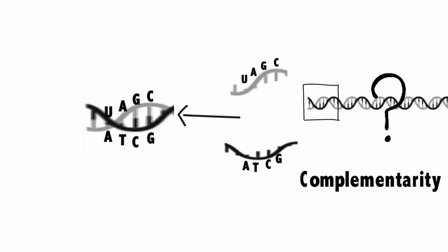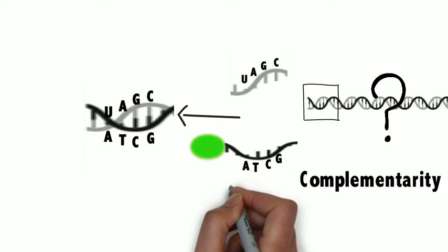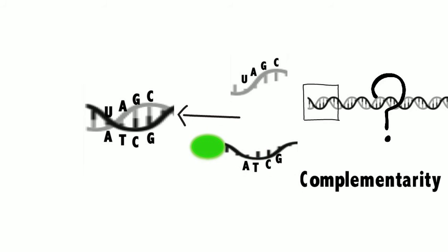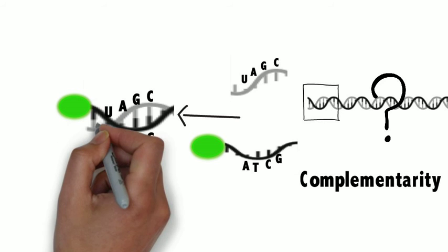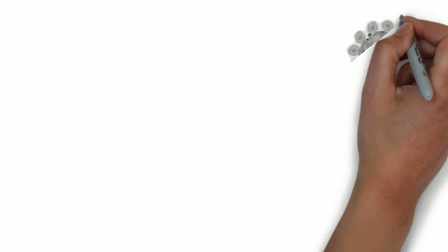So how do we detect this chimera? There are a number of ways. Here we will label our probes with fluorescent molecules. This labeling of the probe will help us detect the hybrid molecule with fluorescence. Now let's put all of this into the context of an application.